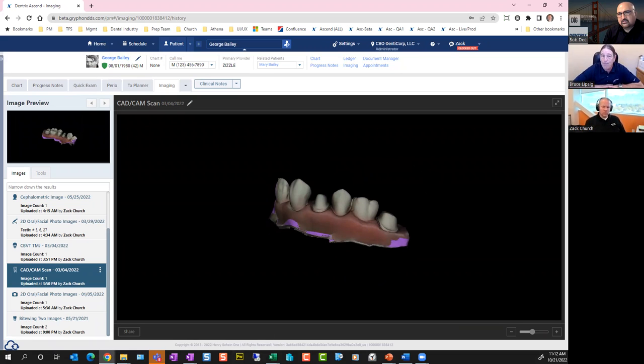Is acquisition on the roadmap at all, or is that something that's becoming very complicated now? No, it's becoming easier and easier. We had one slide that shows how hardware is maturing and growing up. And CAD CAM and cone beam are very similar right now.